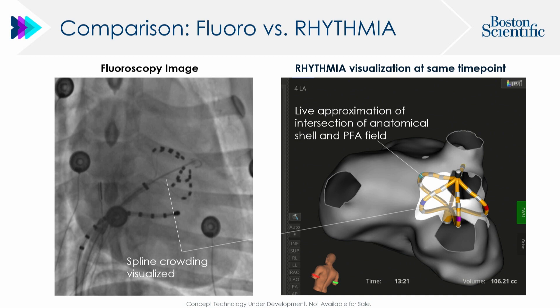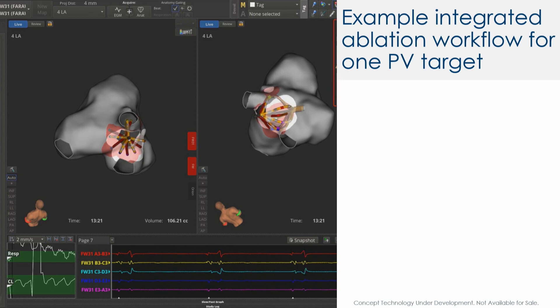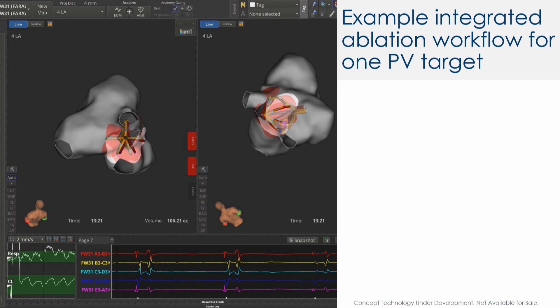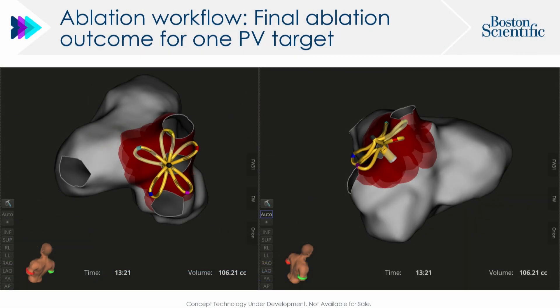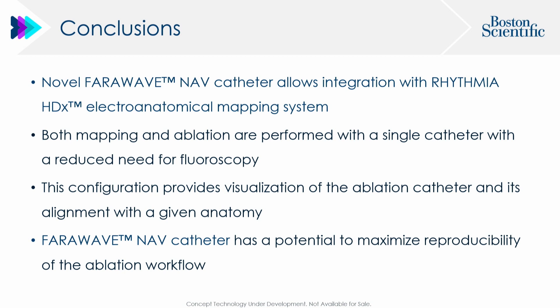You can see what appears on X-ray, but here you have a nice map with the left-sided veins and right superior vein. Going vein by vein, you can apply pulse field energy and see the zone marking the area of application, then rotate the tool without X-ray, get in between two petals and apply again, resulting in a very nice display of applied energy without the need for extra mapping. This new development can improve workflow, allow mapping with the same ablation catheter, and maximize reproducibility of the ablation workflow.